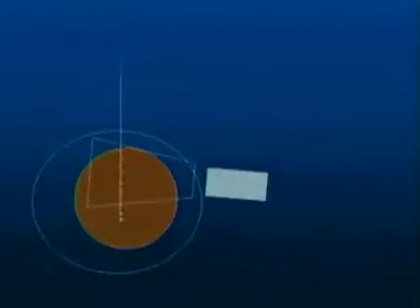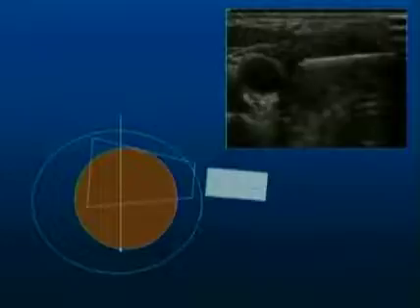Here's such an example that I'll show you in the right upper hand column, in which we're doing a thyroid biopsy and we can see the entire shaft of the needle because the needle shaft is perpendicular to the ultrasound beam.